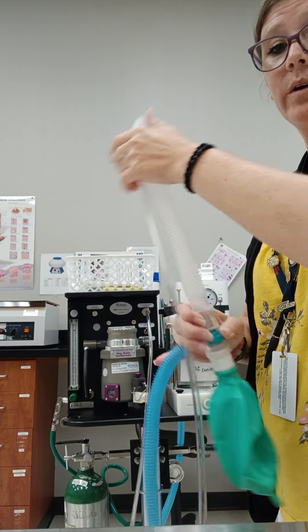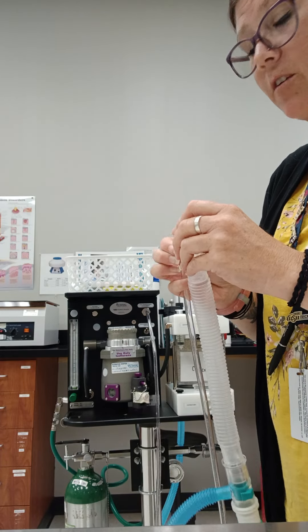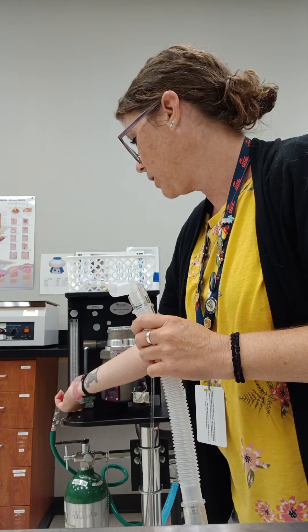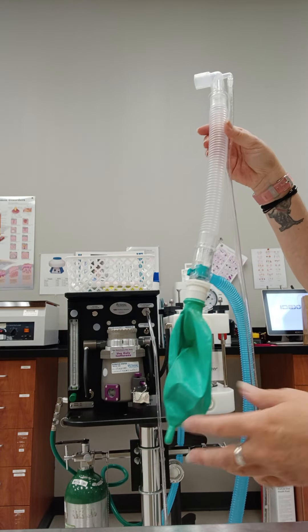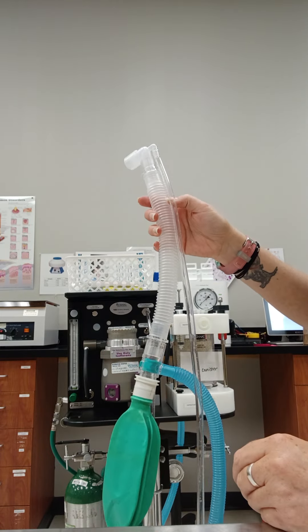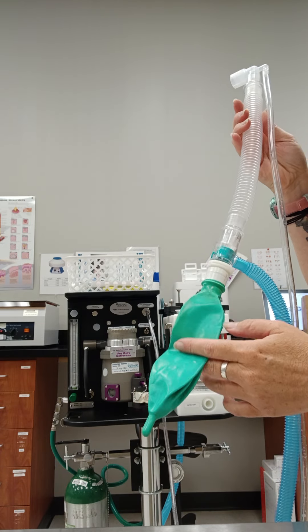We can always double-check that all of our connections are nice and snug on all pieces of the tubing. If anything's loose, it's going to have a leak and it's not going to hold that pressure the way that it should. With these examples we've done on both machines and your non-rebreather, it's likely something to do with the non-rebreather not being connected perfectly tight. We did just use this bag on the rebreather setup and it held perfect, so that tells me it's not the bag.